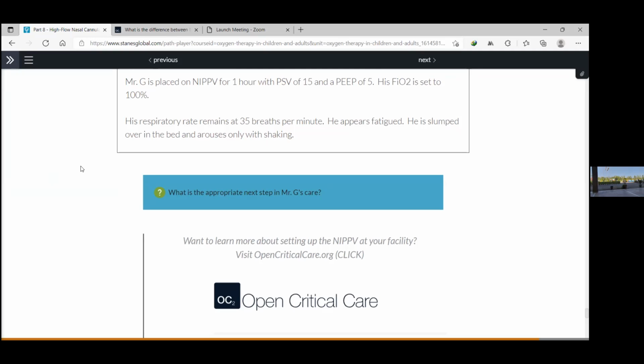Overall in the world as well as in our country, the COVID-19 infection rate is escalating, and we have to be careful and strict with our PPE, as the Omicron variant is highly transmissible. So when you are using high flow nasal cannula or non-invasive ventilation, please be careful and use personal protective equipment.